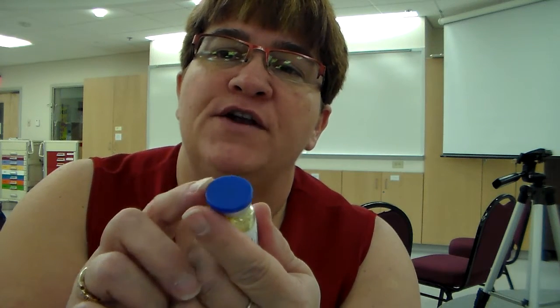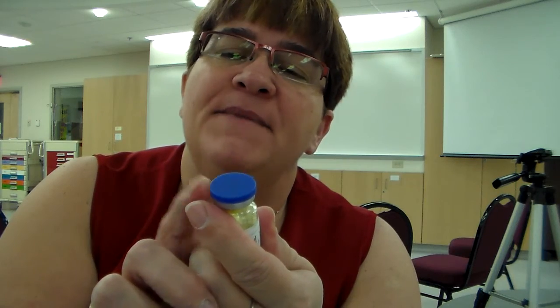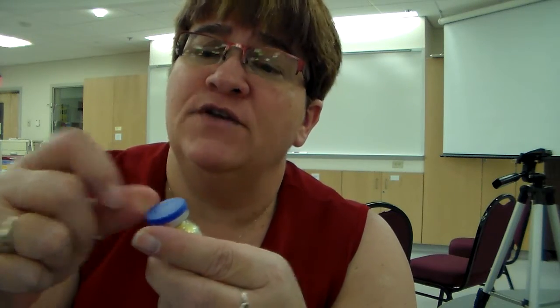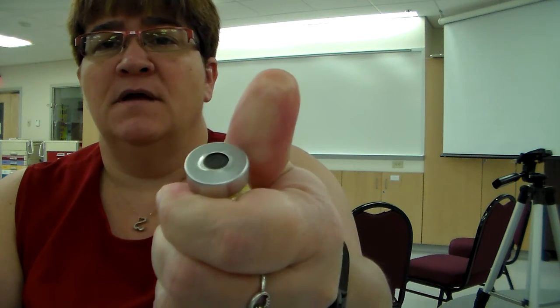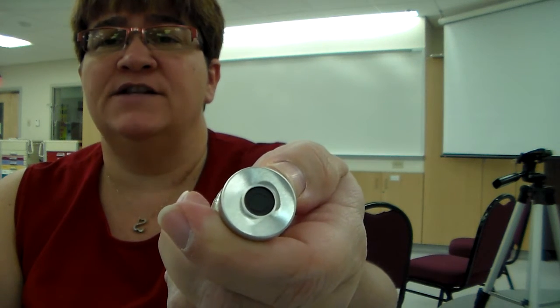All right, so we're going to remove the protective cap from the vial. When I say that, most vials that are brand new will come with some sort of protective cap on the top. It's either blue, yellow, green, orange, gray. It doesn't matter. It's just a protective top. You can't put a needle into it. It's plastic. So what you do is you just snap it off. Push up with your thumb, and it pops right off. And see how you've got the rubber part now where you can insert a needle.